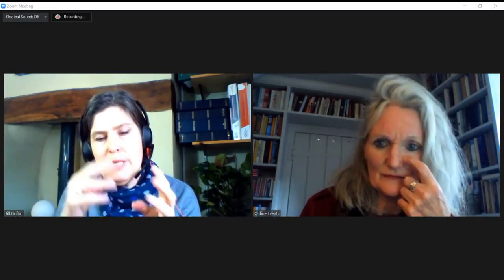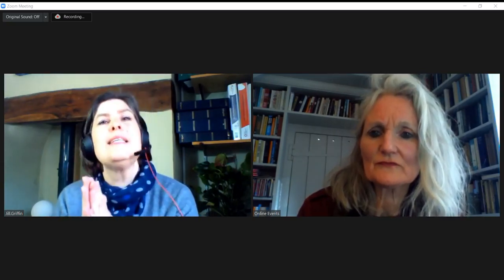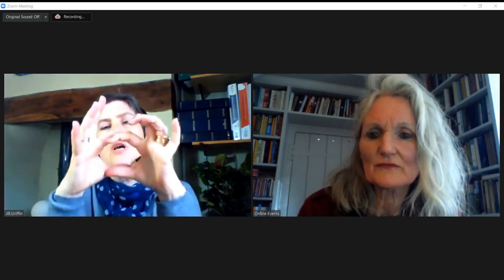Okay, so the DEXA scanner is a measurement tool. It's a bit like a ruler. It will tell you how long something is, but it can't tell you what colour it is. We do get images from the DEXA scanner, but they're very poor quality, very low resolution, and don't give us an awful lot of detail. But we can see the area of the vertebral bodies. Vertebral bodies are the big chunky building blocks in our spine, if you like. So we can see if they've been squished down. We can see if there's lots of degenerative change there, but it's not definitive. We can't say categorically this is a fracture.